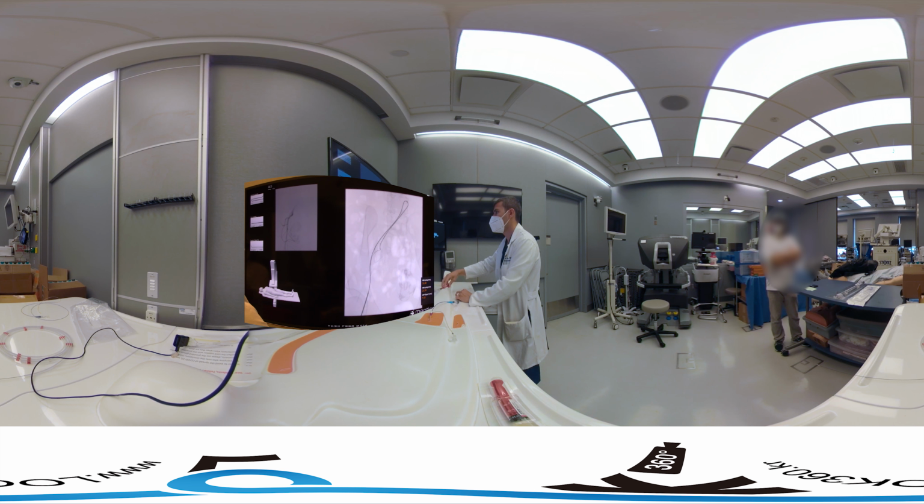Here we go. So we're just before it, and we're going to come back a little bit. And right there, it's engaging in the vessel that we want. We'll get that there, and then we'll bring the microcatheter to follow. There we are. Let's see where we are now. We'll do a little injection here again to see.